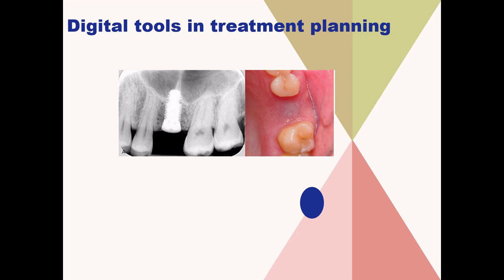So we have already discussed fabrication of a radiographic template and surgical template by using CAD/CAM technology. And here let us see the prosthetic phase of an implant that is placed in the maxillary first molar region using our digital technology.